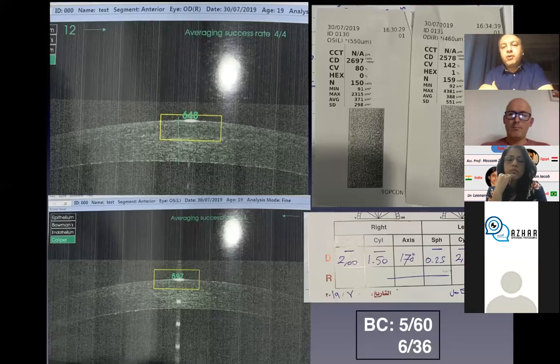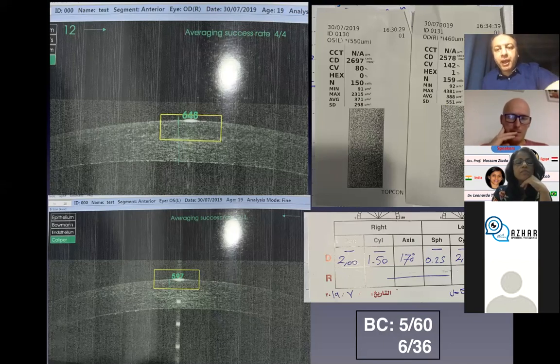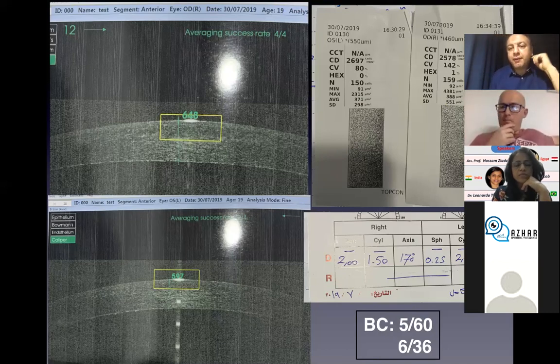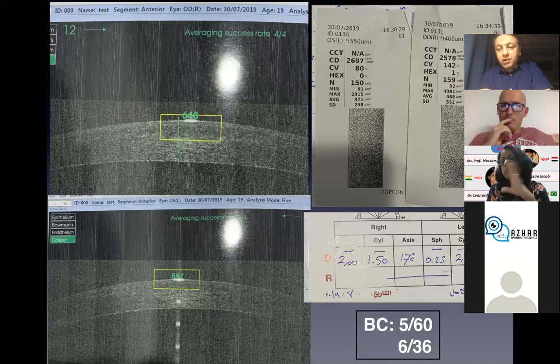This is the anterior segment OCT and specular microscopy for her. Does it help us in something? There is nothing in the bed under the flap. The flap is intimately adherent to the bed. There is no fluid interface. Was there any epithelial thickening, which could again be causing this? An epithelial map may also be helpful in such a situation. Yeah, it's a good idea too.